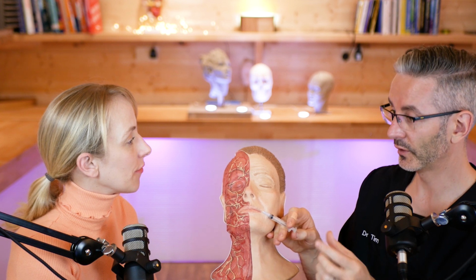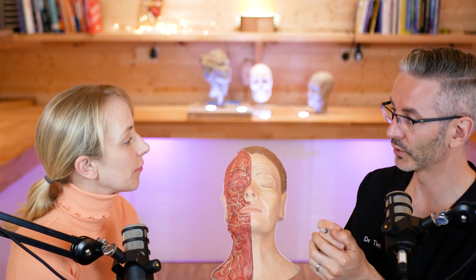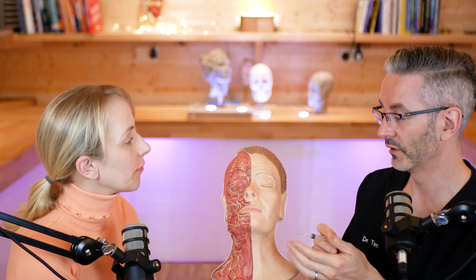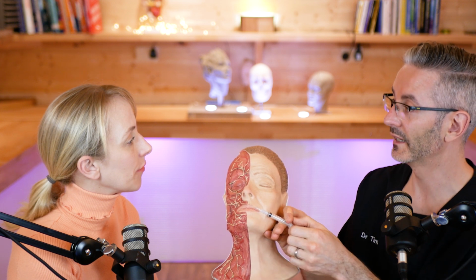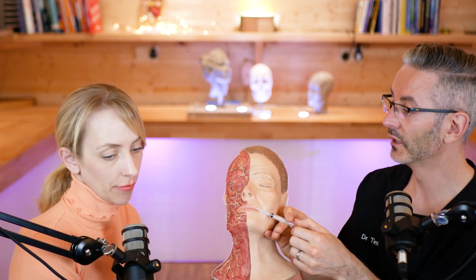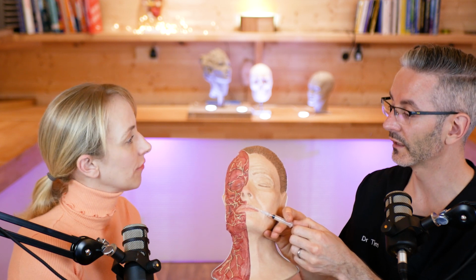That's not 100% because you're still moving a little bit, but each time you're doing it, you're minimizing the risk of having a major portion of that needle in the superior labial artery. So aspirate multiple times. The more you aspirate, the easier and quicker it gets. I often aspirate so efficiently that you'd hardly notice it. It's a little pullback, wait a second.